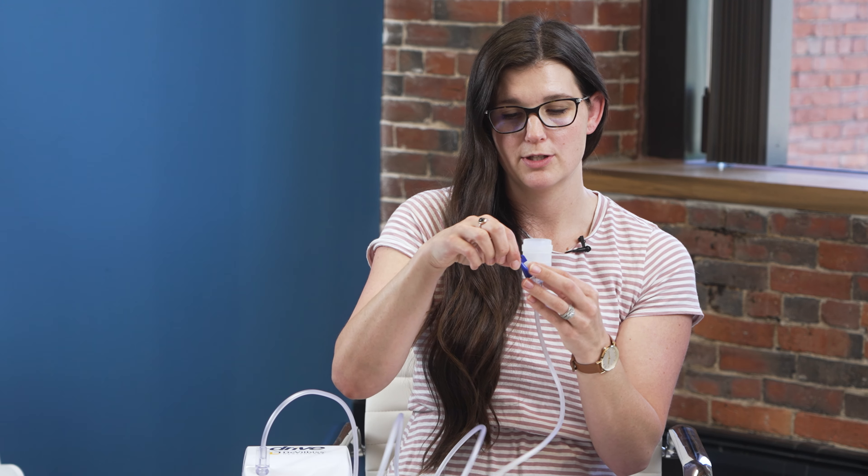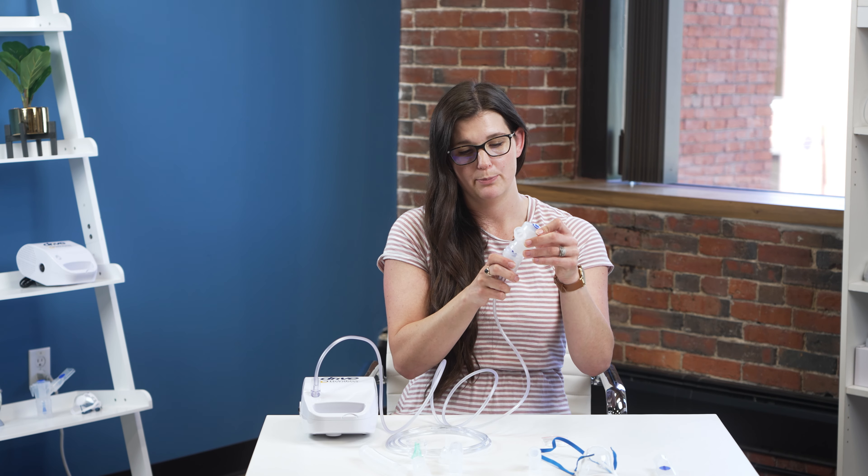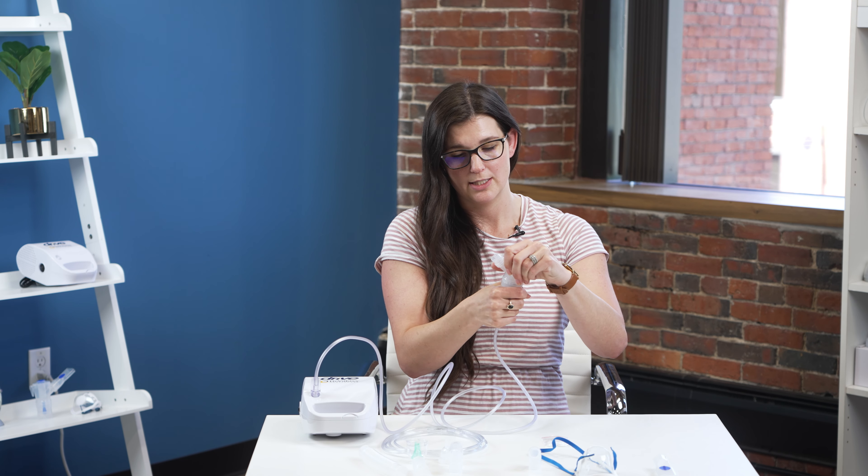Inside the cup you're going to have your baffle, which is this blue piece here. This is very important because if it's not in here, the compressor and the cup and tubing will not be able to actually make the mist for your medication. So you want to make sure that it's placed in there just gently, and then you take the top of the cup and twist that on so it's nice and tight.